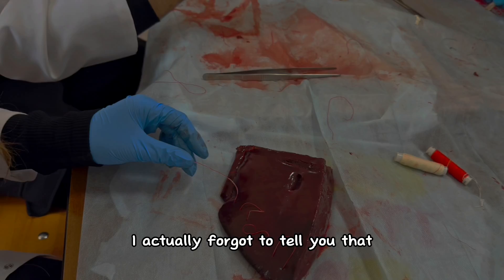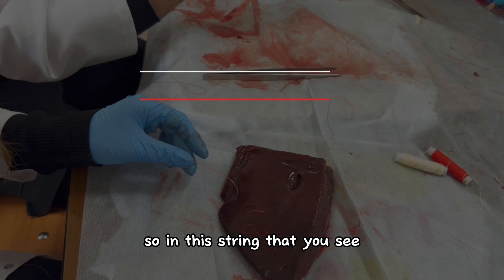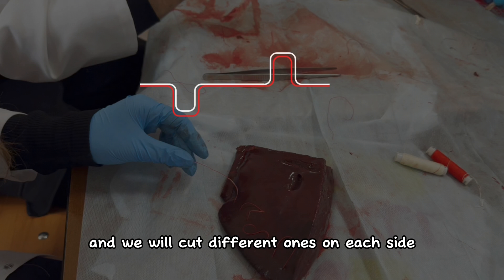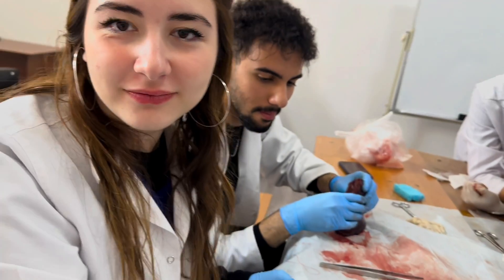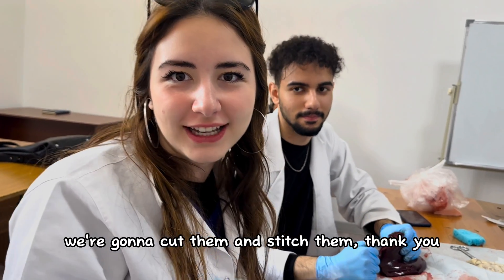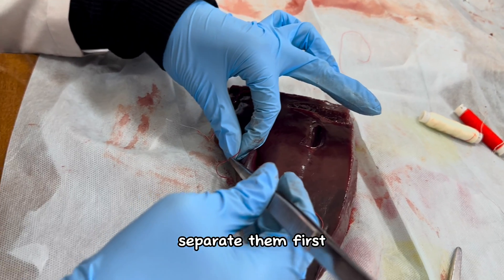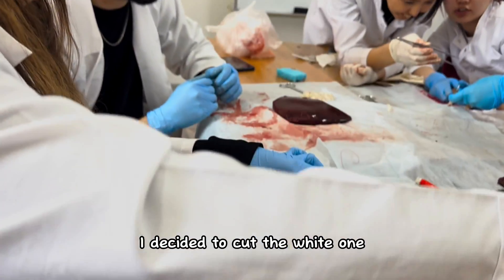I actually forgot to tell you that we started with two different strings — one is red and one is white. So in this string that you see, there are actually two different strings combined together, which is important because later we will leave different ones on each side and cut different ones on each side. We are going to cut one color from one side only — for example white on one side, then the other side will be red. We cut them and stitch them. I decided to separate them first, then cut the white one.